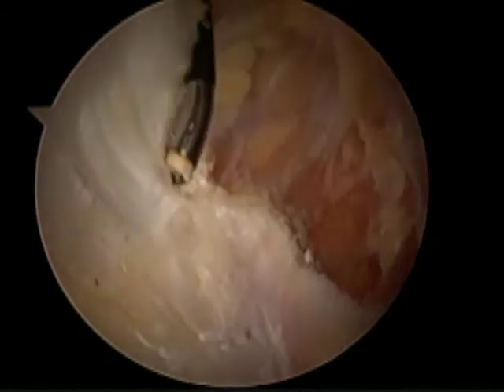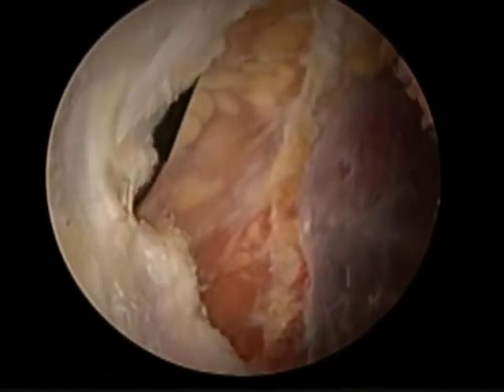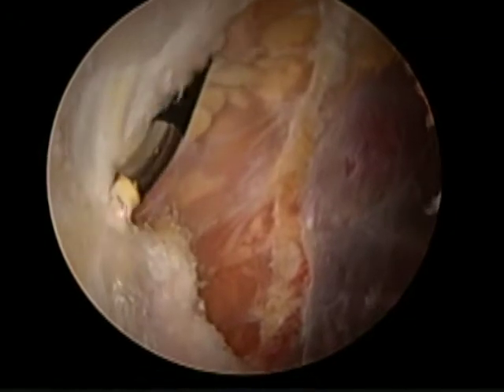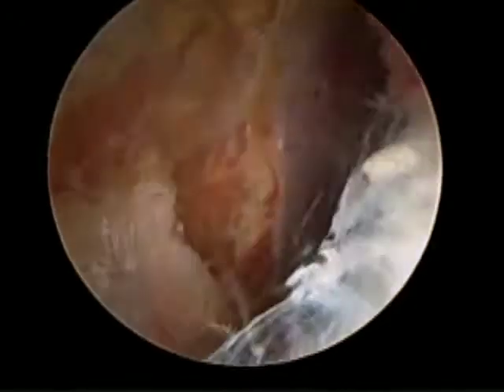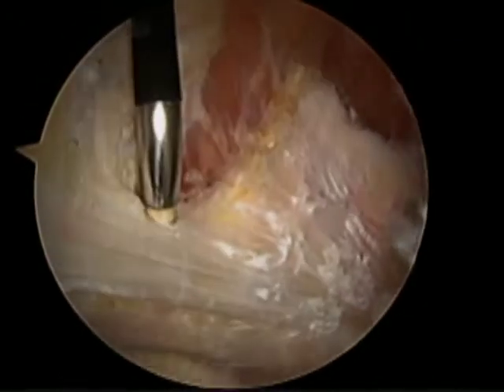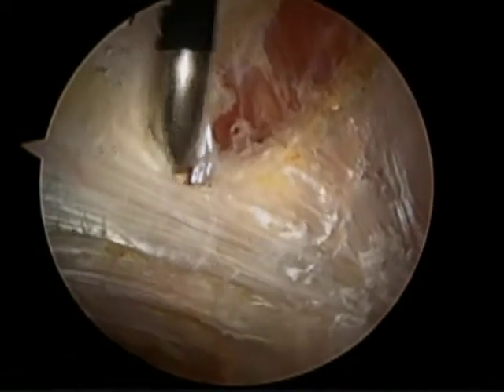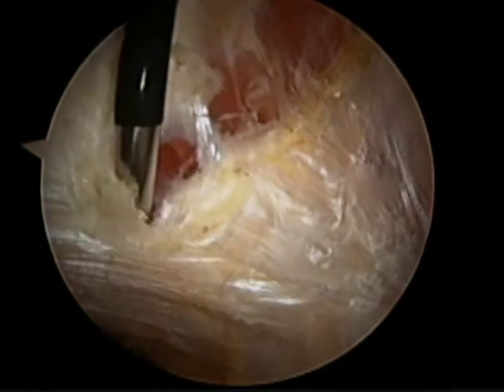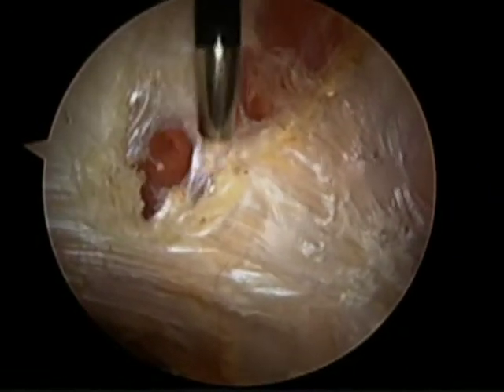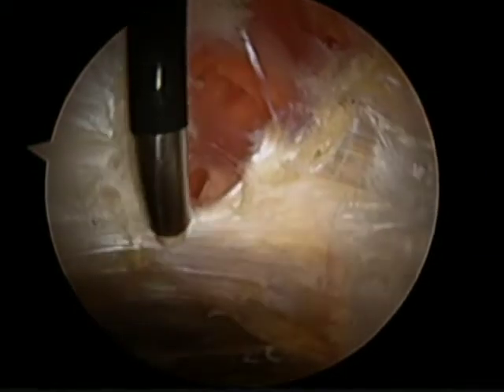We'll then extend a longitudinal incision across the IT band, crossing the gluteus maximus tendinous insertion, which is a part of the pathologic structure in an external snapping hip. This longitudinal cut takes tension off of the portion of the IT band that joins with the gluteus maximus tendinous insertion on the linea aspera.